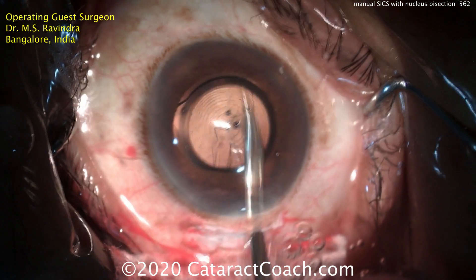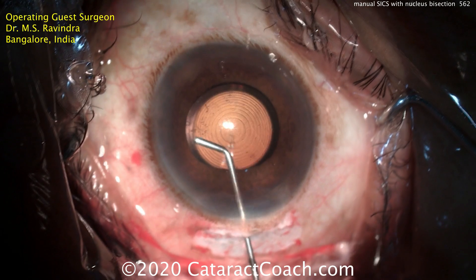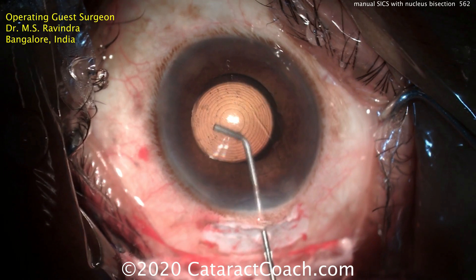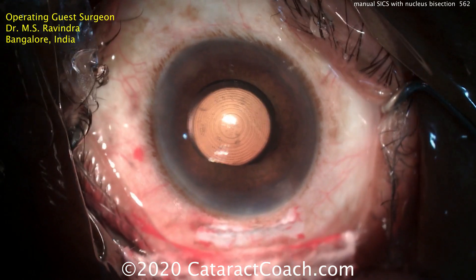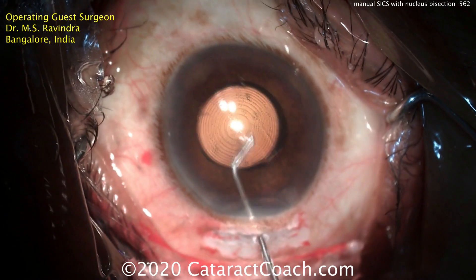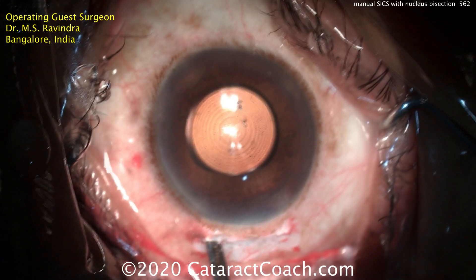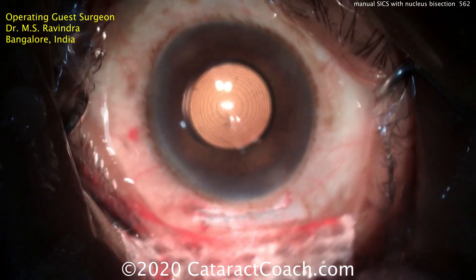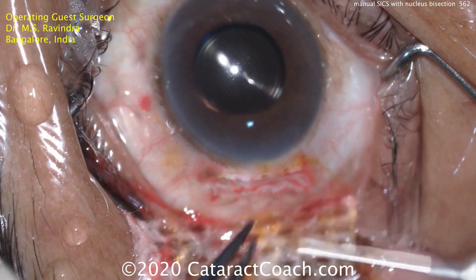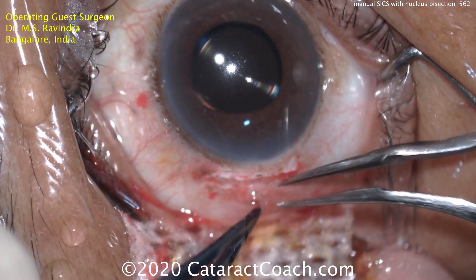The Simcoe cannula goes in again to wash out and aspirate any viscoelastic, and a little bit of hydrodissection can even be done to ensure there's no trapped viscoelastic. The lens looks beautifully centered. Checking the other side as well, making sure there's no retained viscoelastic and getting centration just right. One last check with the Simcoe cannula, then inflating the eye. He's going to seal the incision without sutures — just using fibrin glue. There's the first component and then the second component, which seals the tunnel and helps hold the conjunctiva over it.